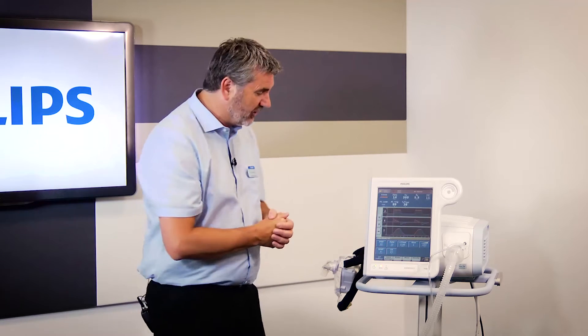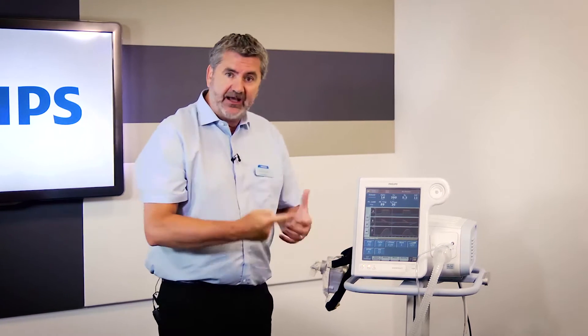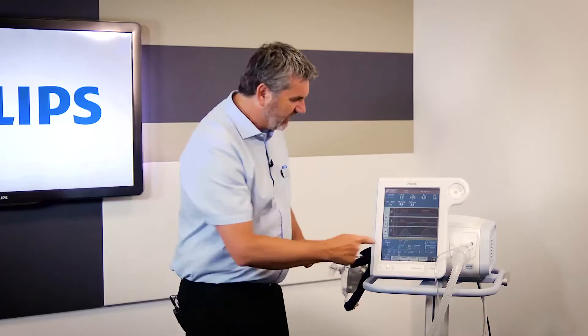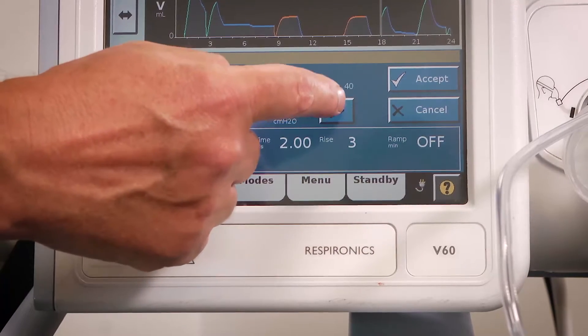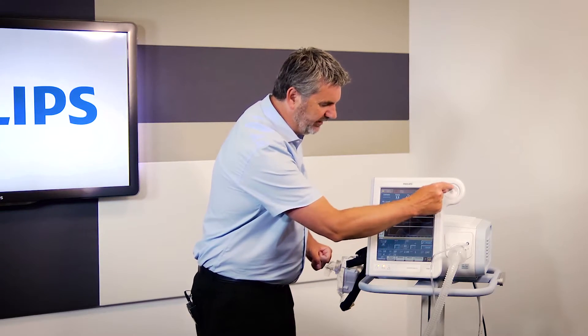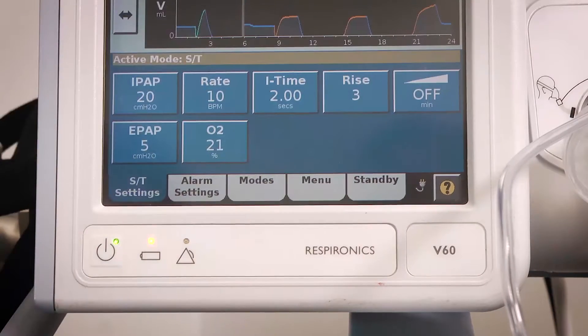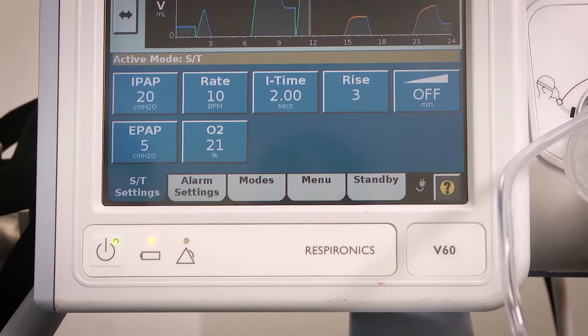This module covers how to change settings on the device. It's very simple — it's a touchscreen, so you just go to whatever parameter you want to change and remember to accept it. For example, if we want to put our inspiratory pressure up to 20, we can either touch the screen or use the scroll wheel. I'll touch the screen, pop it to 20 — nothing changes until I press accept. Now we've gone up to an inspiratory pressure of 20.